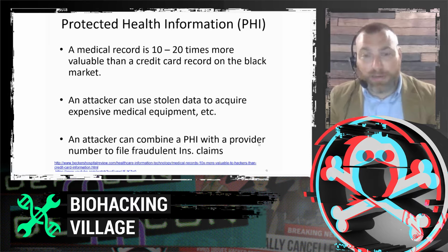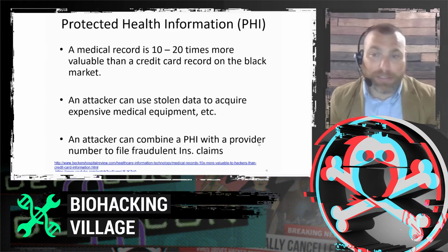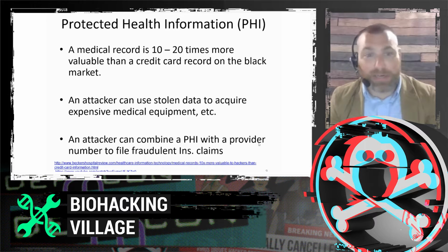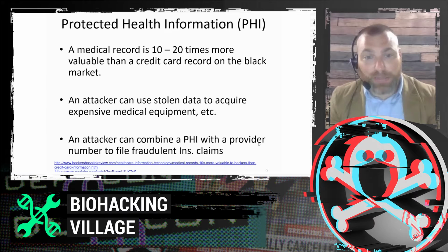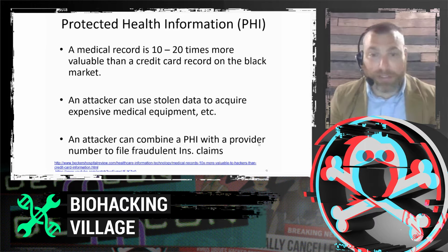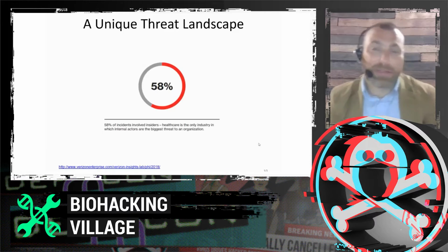PHI, this is probably not anything new to anyone that's currently working in the field, but just in case you don't know, medical record, why is it valuable? It could potentially sell for 10 to 20 times on the black market what a credit card record could sell for. You can't turn off a PHI record, protected health information record, like you can a credit card. An attacker could potentially use the stolen data to acquire expensive medical equipment or technology, and an attacker could also combine PHI with a provider number to file fraudulent insurance claims. Just some possible things that could happen.